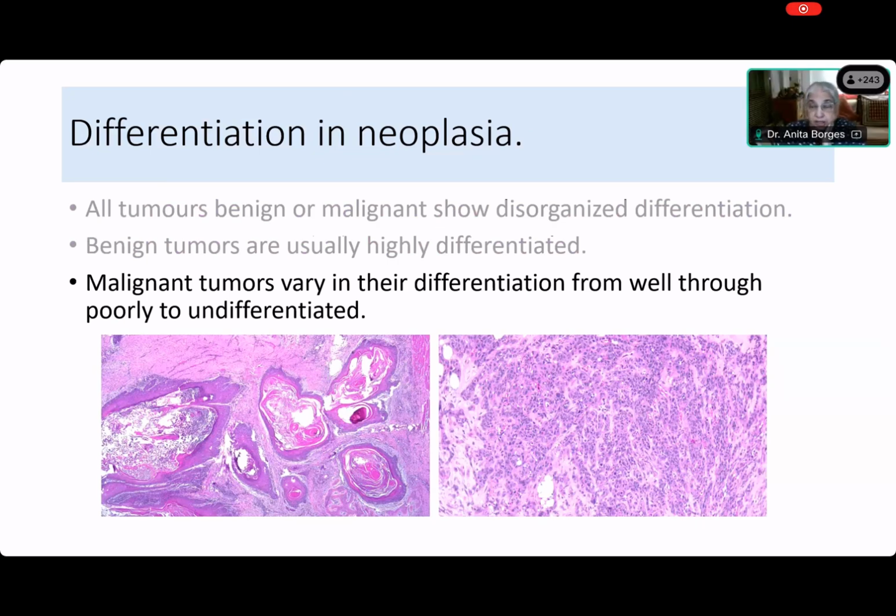And honestly, if somebody didn't tell you that this was arising from the buccal mucosa, which is not glandular, and the most common tumor that arises from the buccal mucosa and is not glandular is a squamous carcinoma, you would know that this is a poorly differentiated squamous carcinoma, and it has certain characteristics. Number one, it is not showing you keratin. It is also very disorganized in the way that it is infiltrating. It's not forming nice little nests.